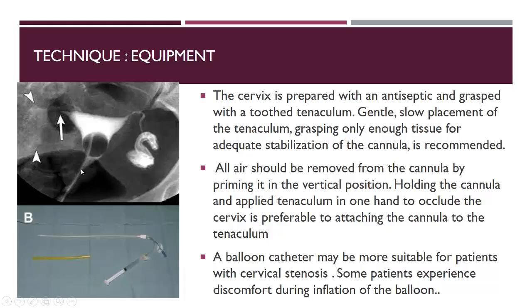This is the balloon inflated, but here I have a comment. When you inflate the balloon at the end of examination, please deflate the balloon in order to see the cervix. Here you have bypassed the cervix, so if there is something cervical, you have already bypassed it. So you have to deflate the balloon and try to better delineate the cervix.